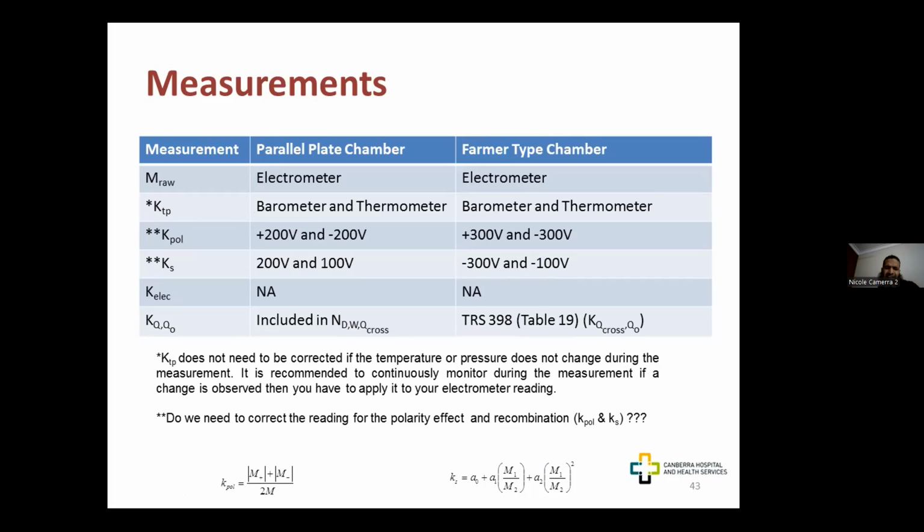because these chambers are vented chambers, they are not sealed chambers. So temperature and pressure affect the number of molecules in the cavity of the chamber, which obeys the gas laws, Charles's law and Boyle's law and all these. There's one called the gas laws, PV is equal to nRT. Remember, long time back we have studied that.